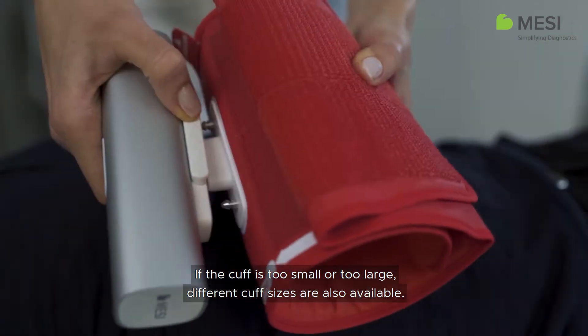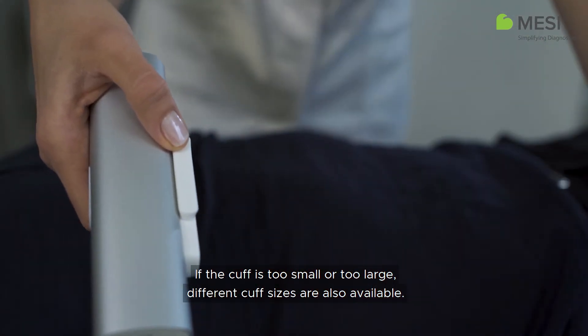If the cuff is too small or too large, different cuff sizes are also available.